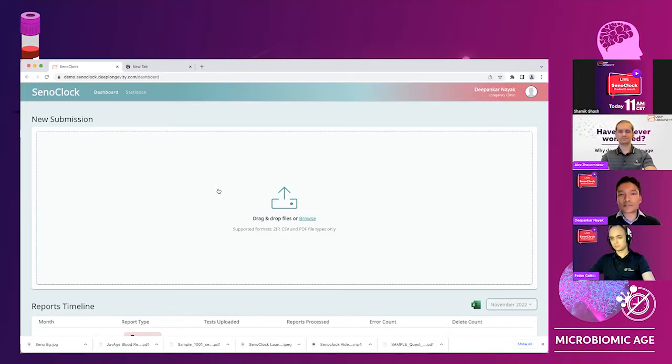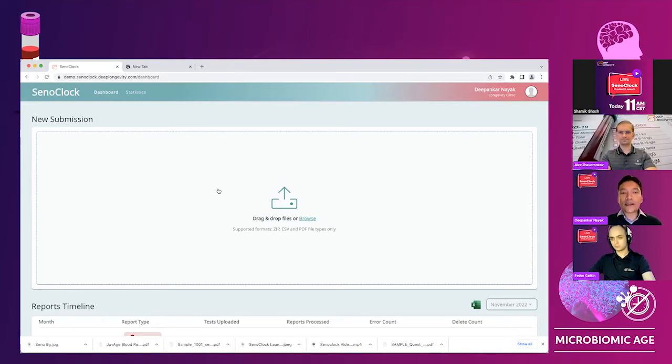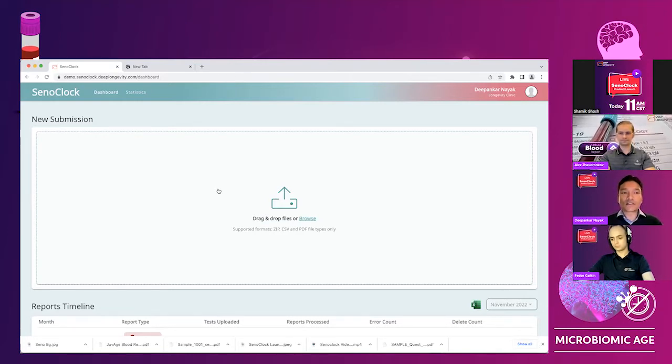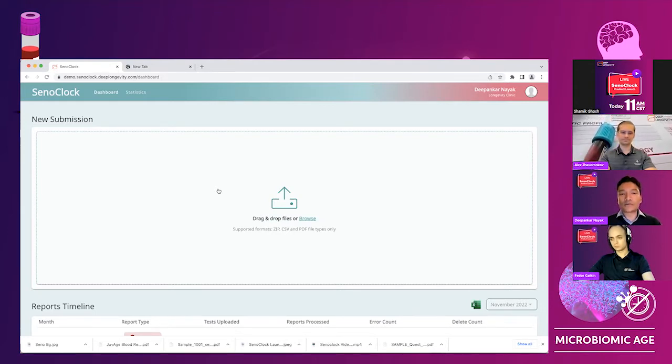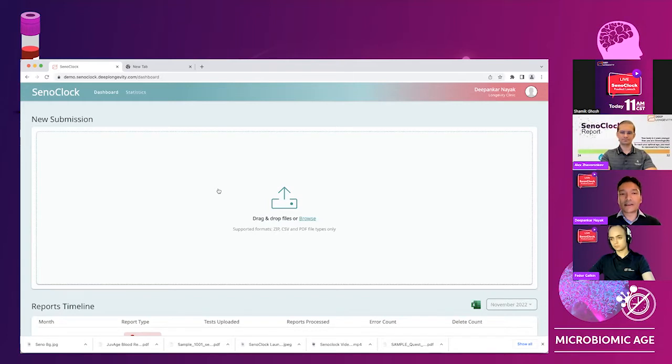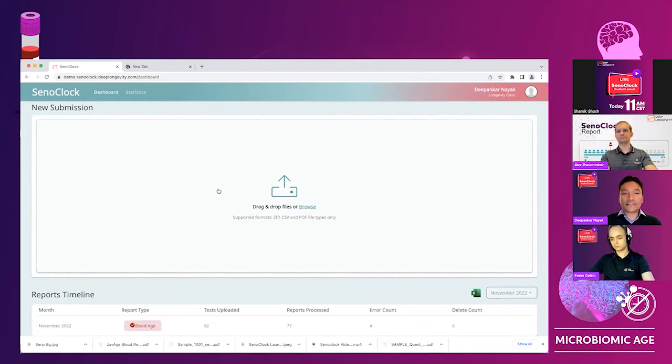Customers, providers, clinics and hospitals will be accessing this URL senoclock.deeplongevity.com. You will have a unique ID and password, which will be your login and your email and your password. And then this is the landing page that you will see.